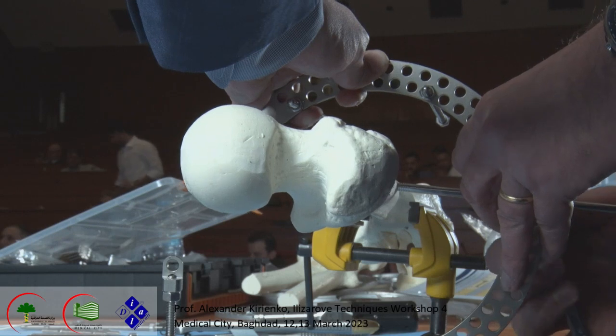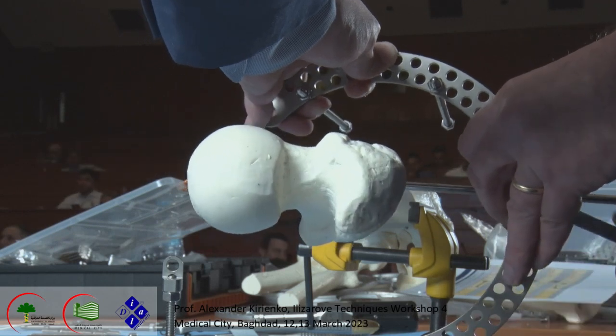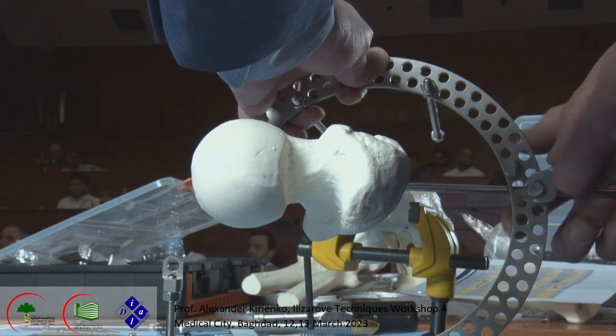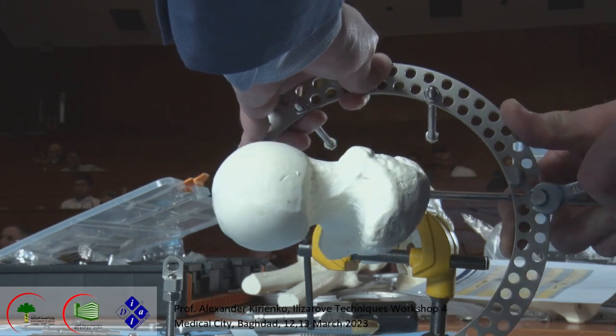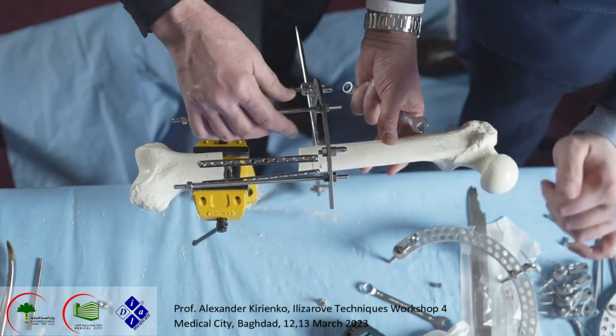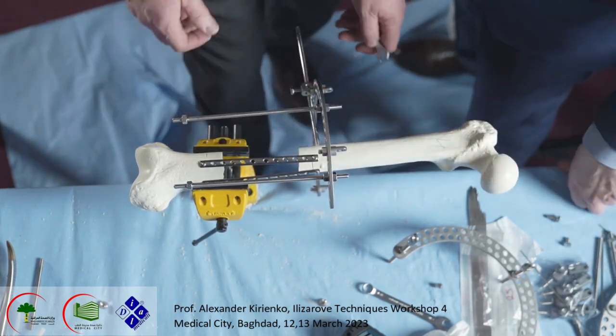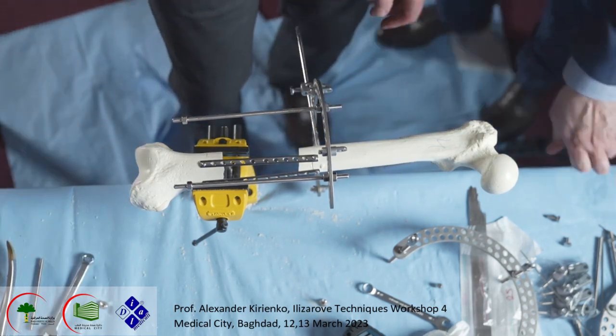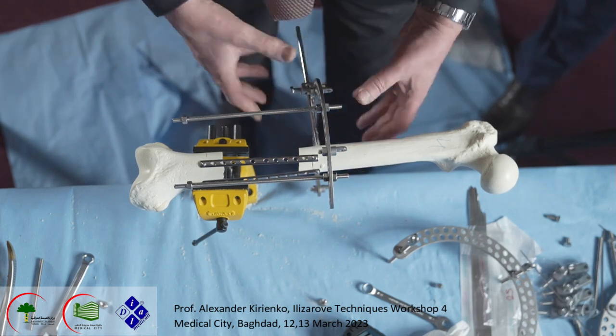Posteriorly, we should leave more space. Okay, this way. And this way we position this half pin perpendicular to the diaphysis of the femur.